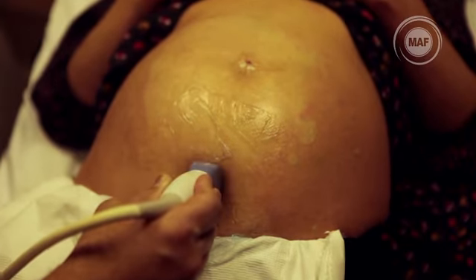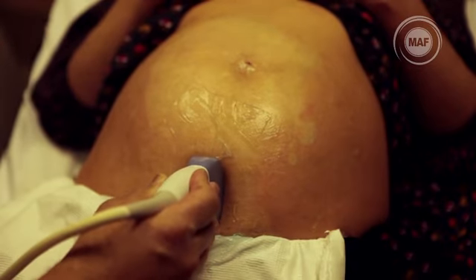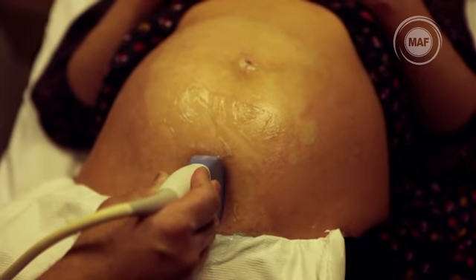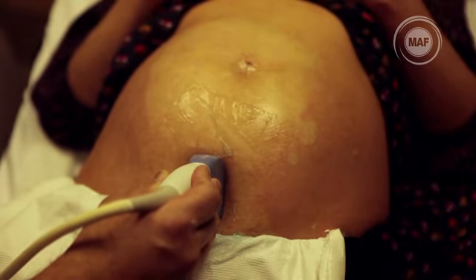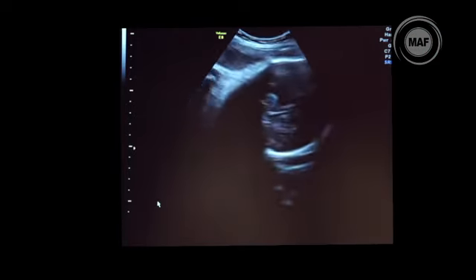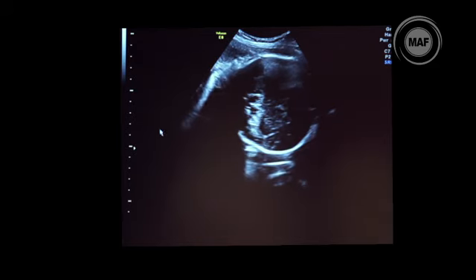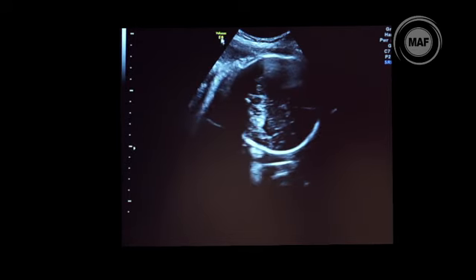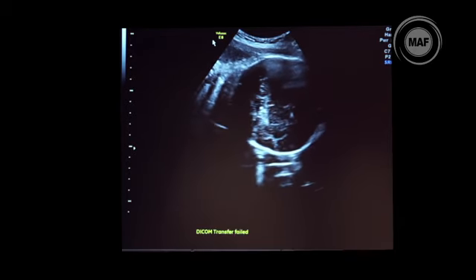This is a longitudinal section with the groove or the dot facing the mother. And the groove and the dot on the probe will correspond to a little marking on the screen. It can be the name of the company, a little dot, a little star, or whatever. Start in the longitudinal section of the mother, and you can see the marker I was talking about. So we know the correct orientation of the probe. The groove is towards the mother's head.